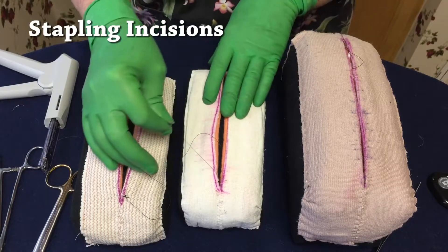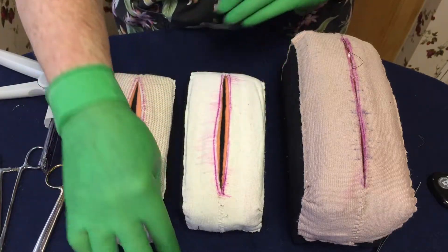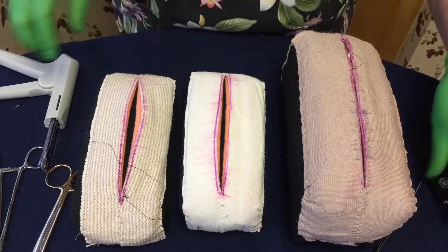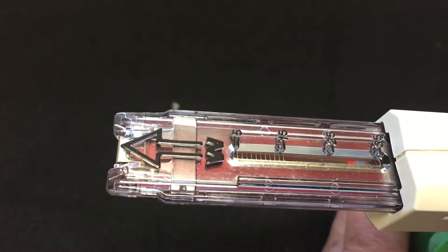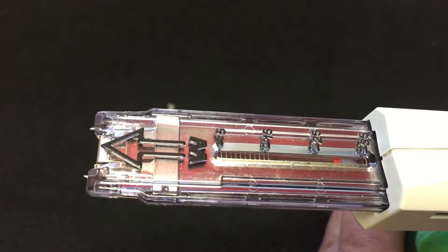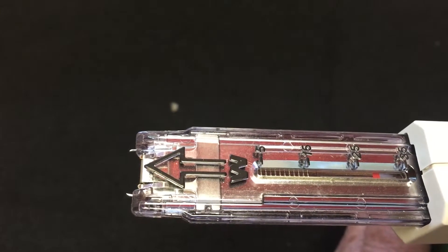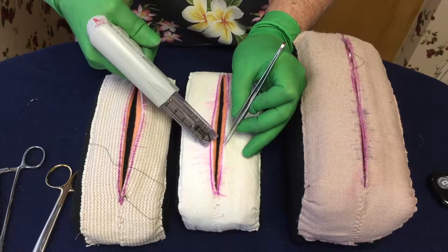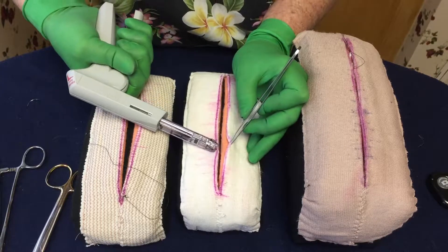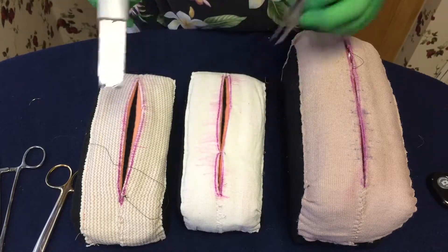If you're trying to staple an incision closed and you don't have help and you've got a gap on it, one of the tricks is to take your skin gun and just partially fire it until the tooth comes out just a little bit. So you have that tooth out a little bit, which is going to be a hook for you. Take one side, pull it in, take the skin gun on the other side, catch the skin with that hook, and then you can go ahead and staple. You don't need the doctor to help you.